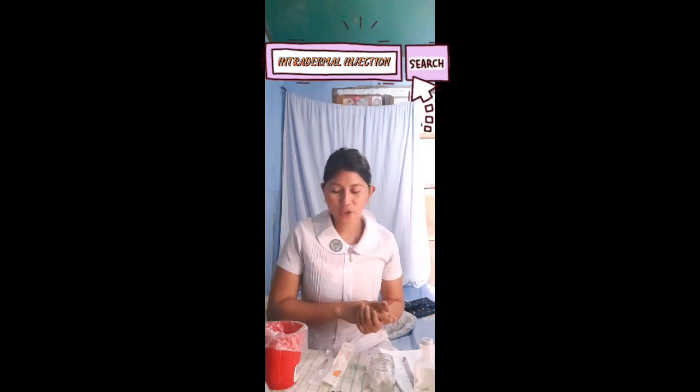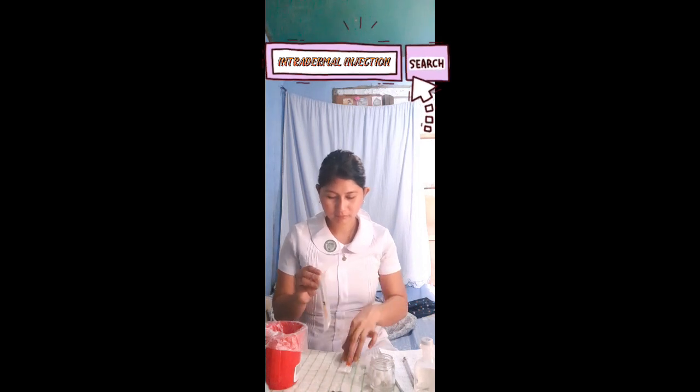Open the tuberculin syringe from its sterile package. We can touch the barrel and plunger of the syringe. Put the aspirating needle on the tuberculin syringe, then uncap the syringe. The volume of air that needs to be drawn inside the syringe is equal to the amount of medication.